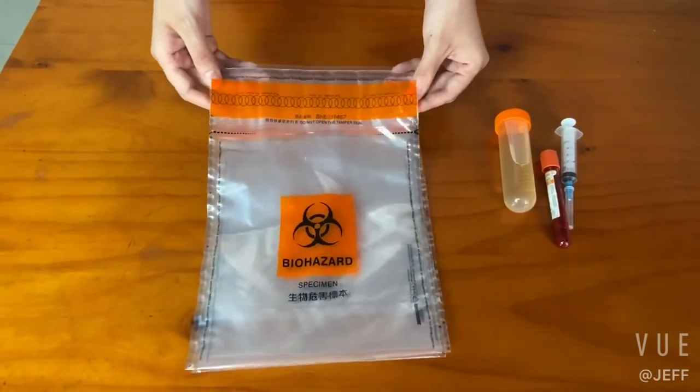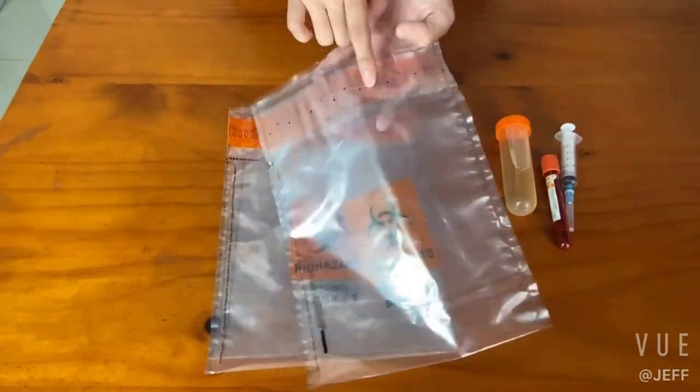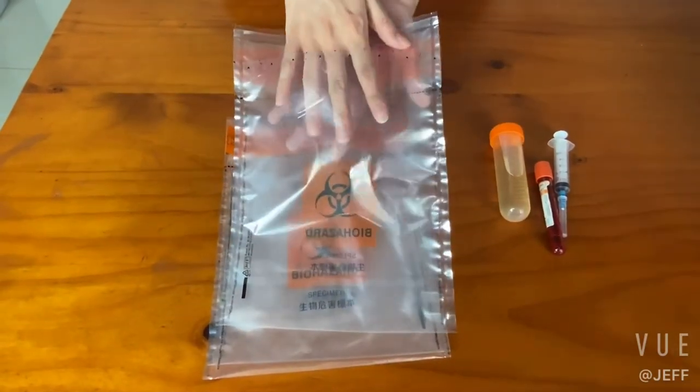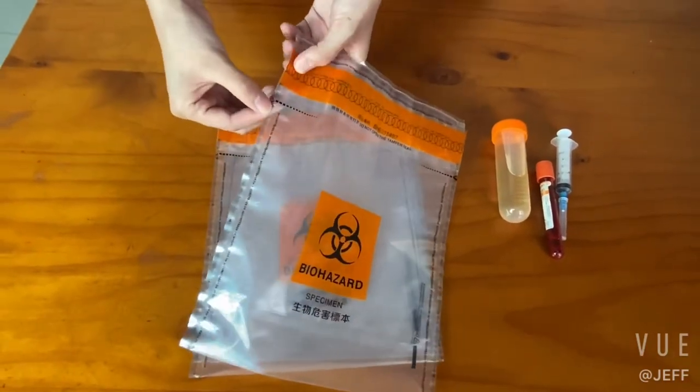We also have an additional pouch design. Here we can see the arrow pattern at the opening, and we can put the relevant documents into the pocket. The tearing design here makes it easy to open the bag.